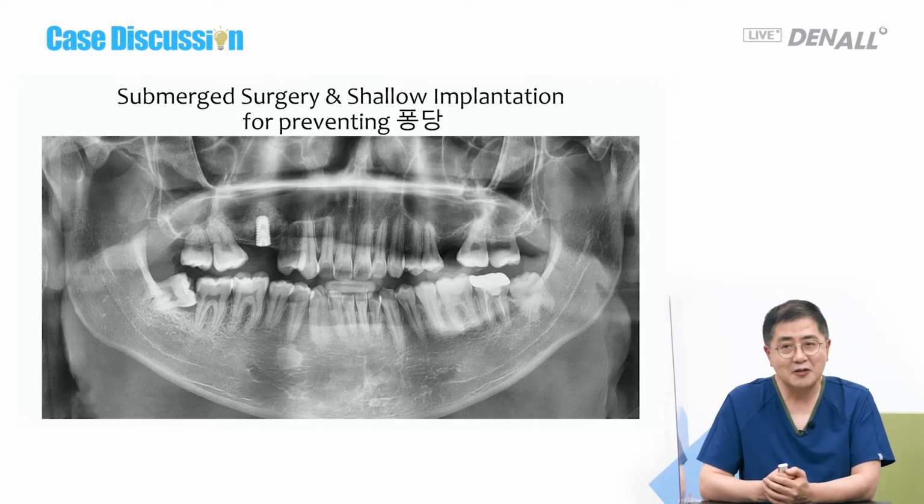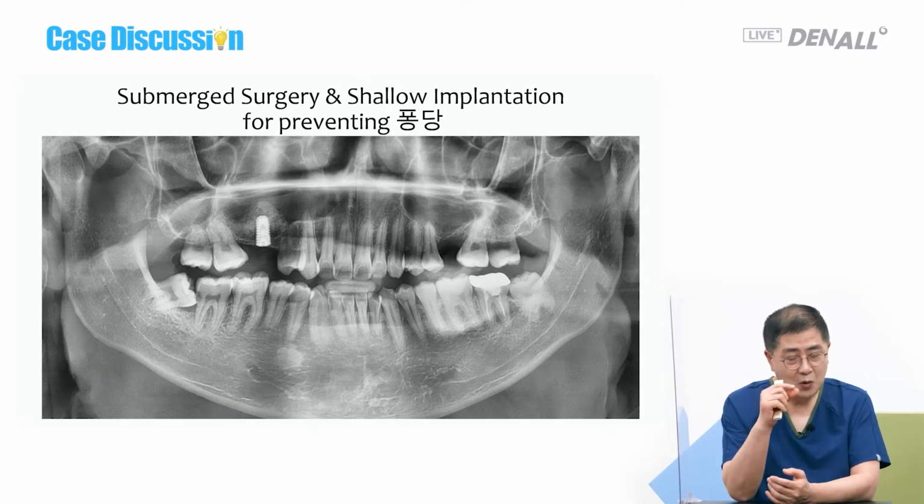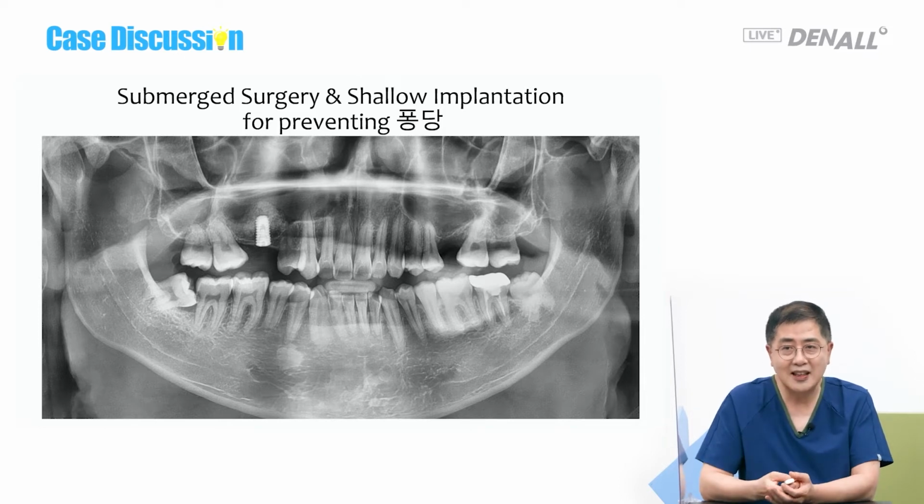Dr. Cho Young-seok came to my clinic and did the surgery. The bone thickness was 1 or 2 millimeters. Using that thickness, a TS implant was placed. Very sensitively, the cortical bone is used. For the placement, I use SS implants rather than this technique.